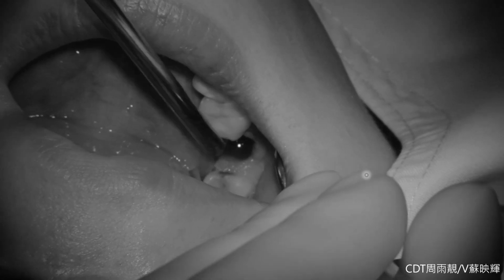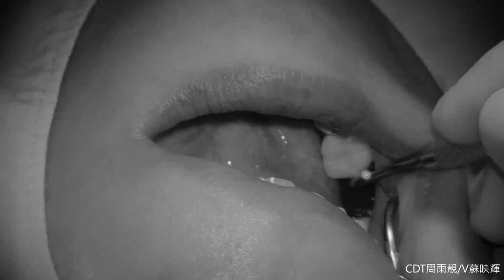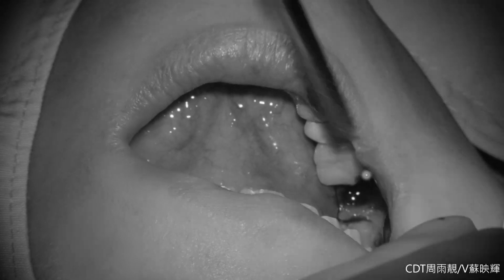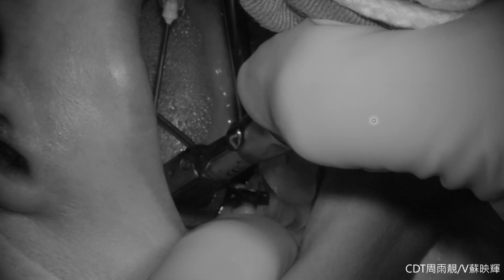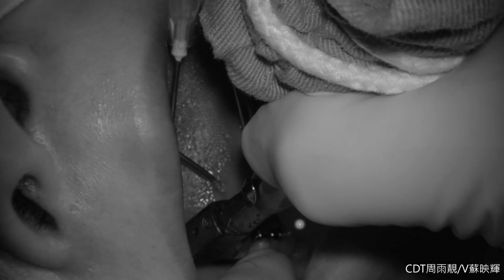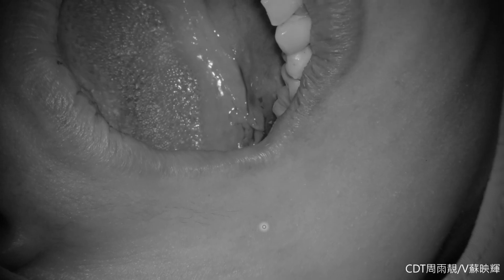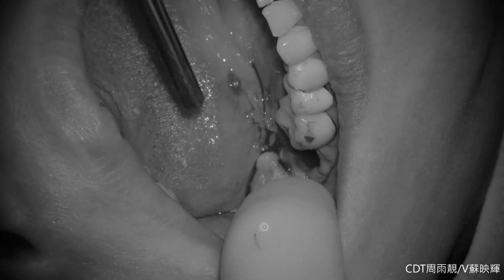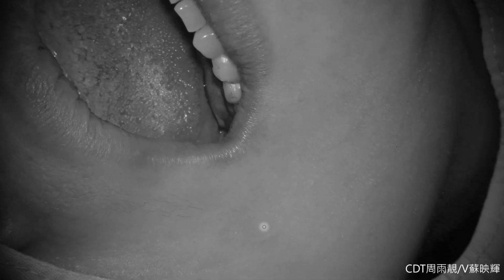First, we remove the vertical root fracture tooth. And we quickly clean the socket, remove the granulation tissue here. And we drill the extraction socket with our drilling guide to prepare the socket. And after that, we check if there are any undercut or any interference. We can put our analog tooth in it.